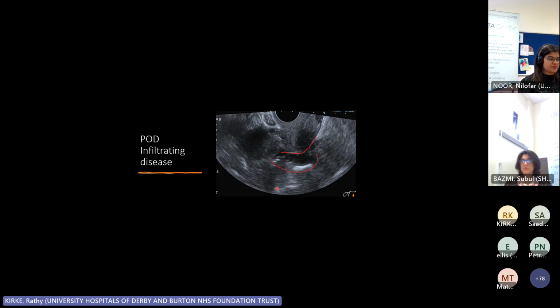If you go straight to the cervix, quick cervix, I'm happy with the cervix, into the endometrium. Let's look at that. Let's look at the ovaries. And then you've got to start looking for the deeper, the posterior signs, the signs in the pouch of Douglas.